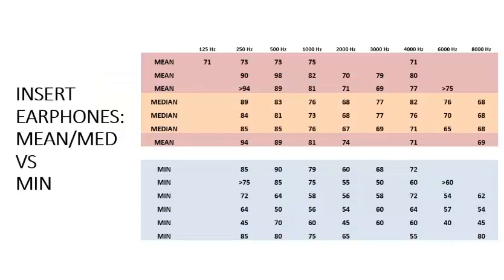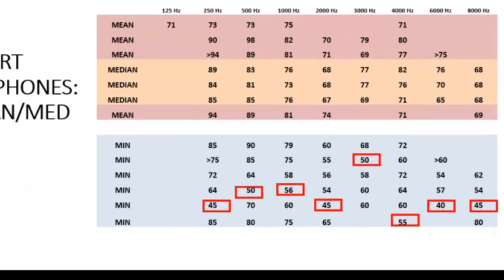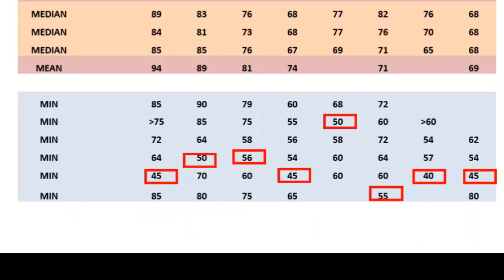Here are the average or median and min-IA values. Just a rough look at the information. We can see that the values are higher than they were for TDH headphones. Having higher attenuation overall will be beneficial to us as people who test hearing. So that's one of the good things about insert earphones. Here are the min-IA values for various frequencies using insert phones.